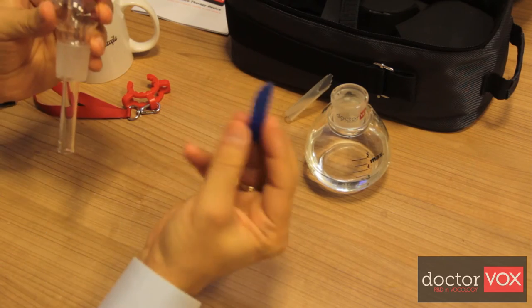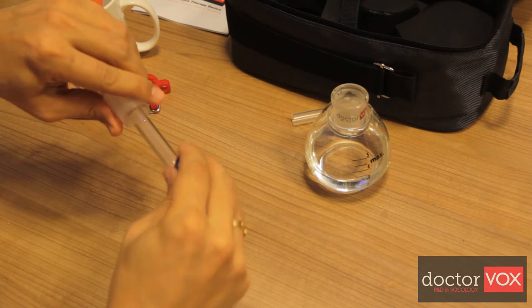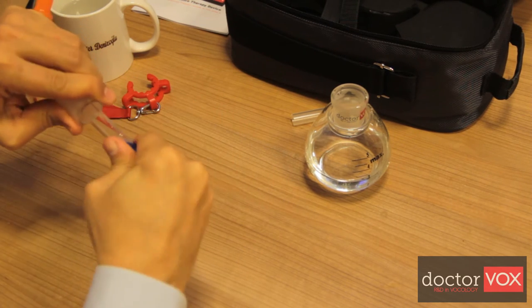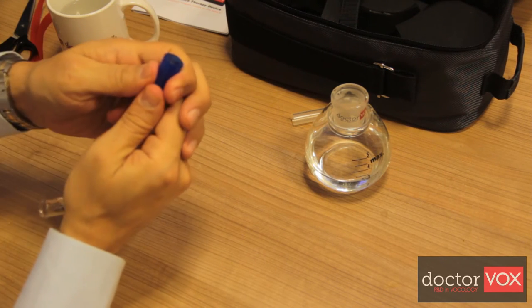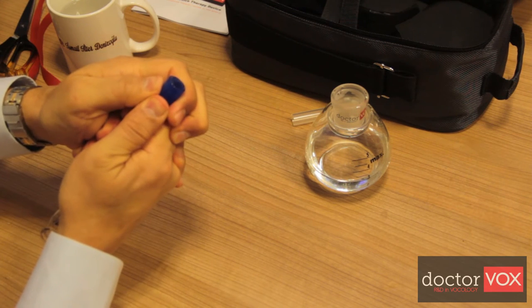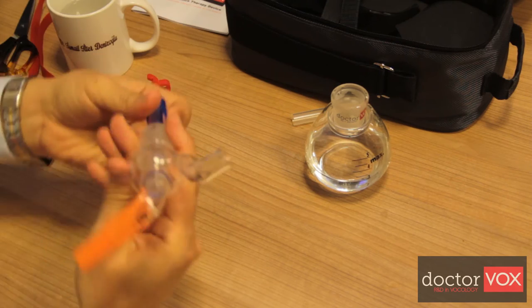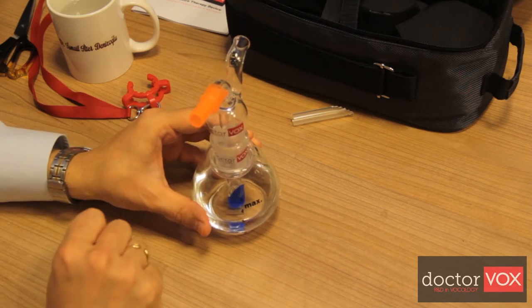The tip tuner can easily be mounted by dipping it in water and mounting it to the end. If you want to increase the back pressure, you can extend the silicone tube and then put the upper part back.